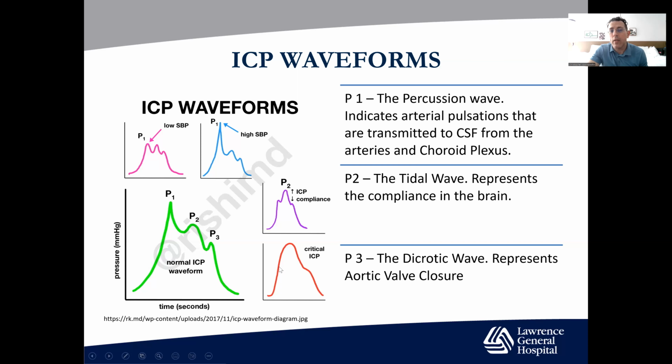And then lastly, down here, if you were very unfortunate to see this particular waveform, this is what a critical ICP looks like: the pressures are so high that you don't even have P1 and P2 anymore.